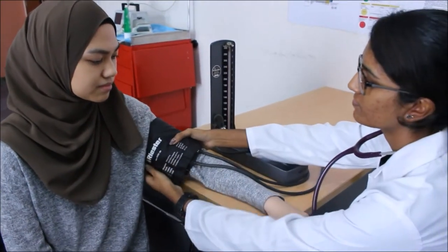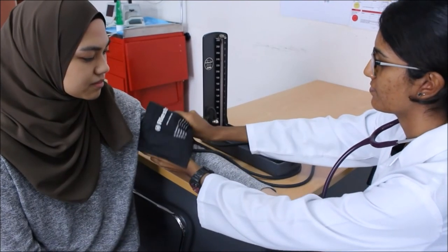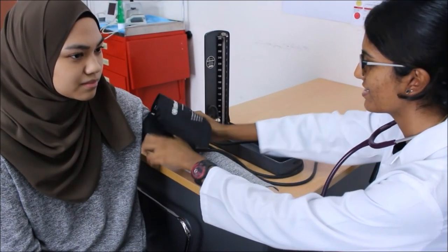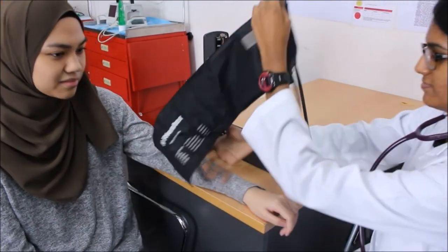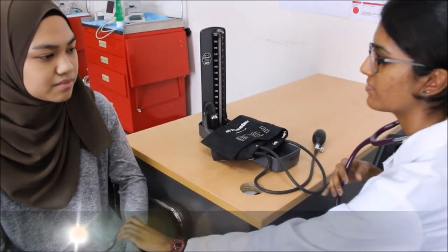Finally, remove the cuff from the patient.